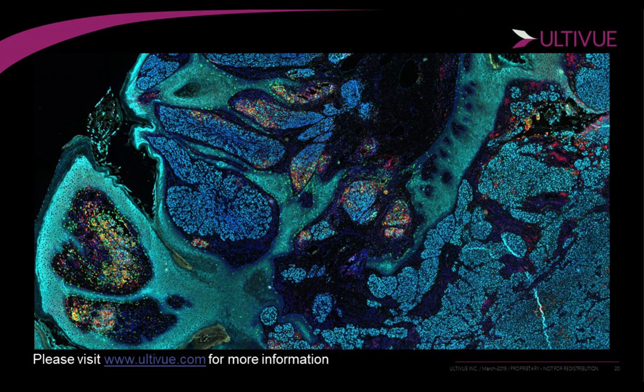What you really need is a good primary antibody, ideally a clinically relevant clone or something that's been well published, something that has extremely good staining patterns. It's a good high-performance primary antibody. We'd need that in high concentration and carrier-free, and then good control tissues to really base our staining off of, and that's really where we start. So a good quality antibody in high concentration that's carrier-free.